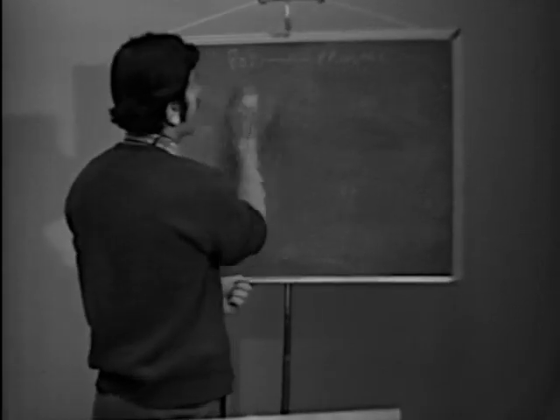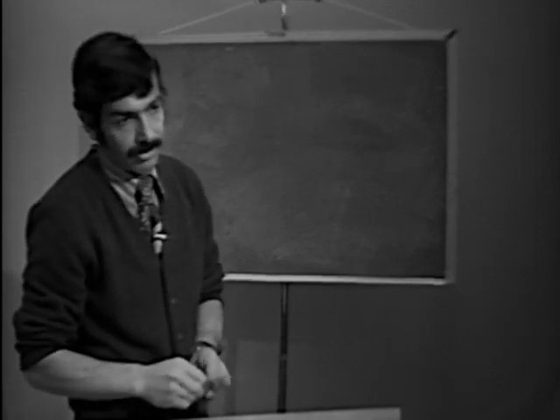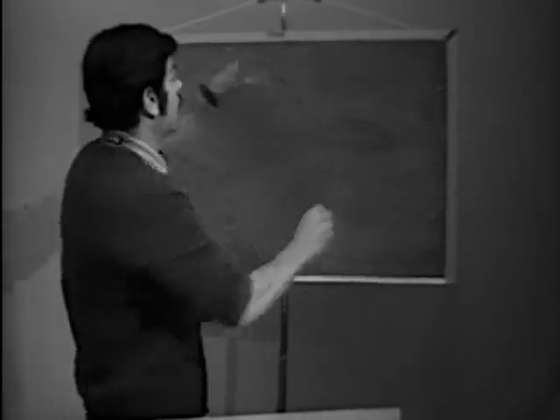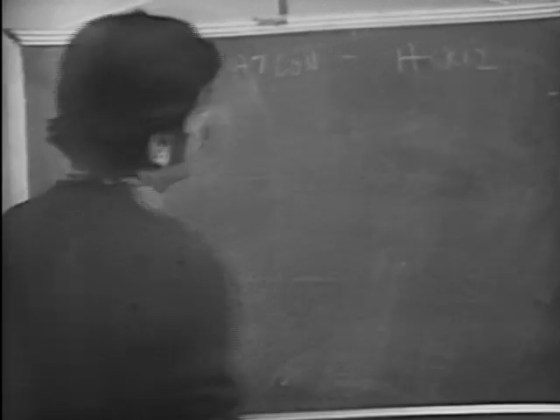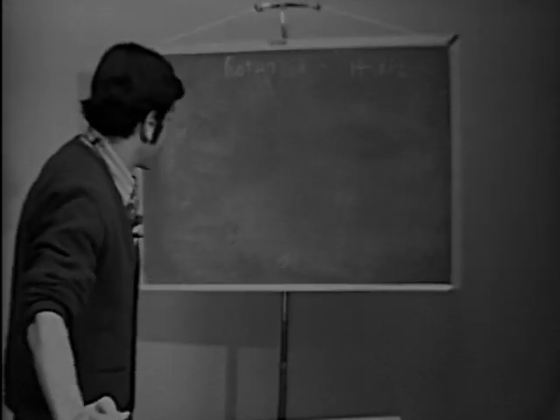Okay, now talking about rotation. With position, we're dealing with the frontal plane, as I indicated. With rotation, we're dealing with the horizontal plane, the V leads. All right, so let's make a little diagram here.